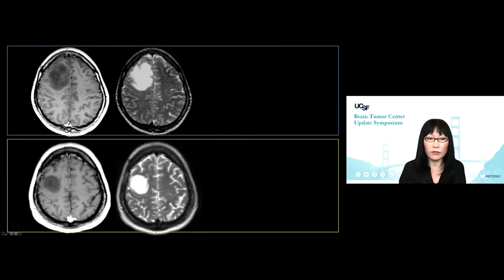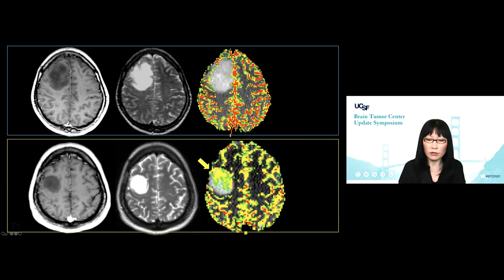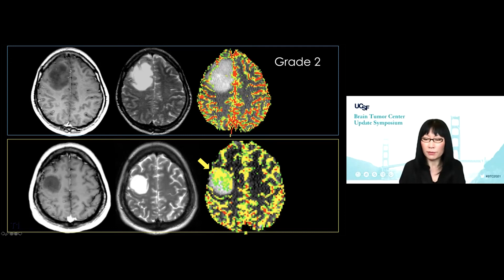We also use perfusion to figure out: is this a good tumor, neutral tumor, or malignant tumor? Both patients have a right frontal tumor — here's T2, they look very similar. But once you add perfusion, you know that the patient at the bottom has a true increase in blood volume within that tumor. These are both path-proven — grade two versus grade three astrocytoma.